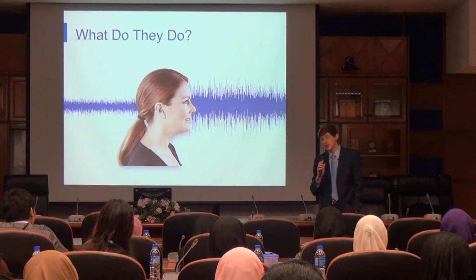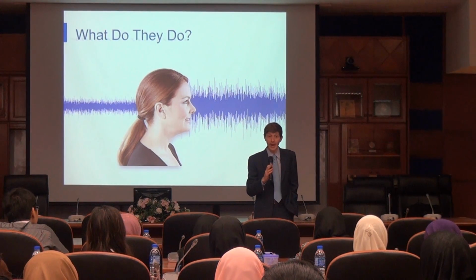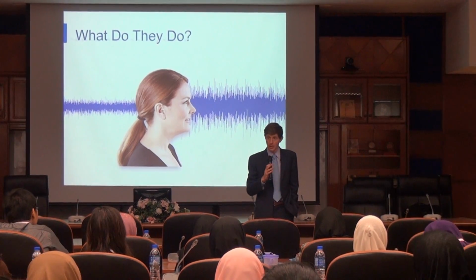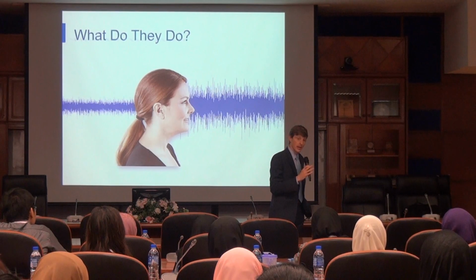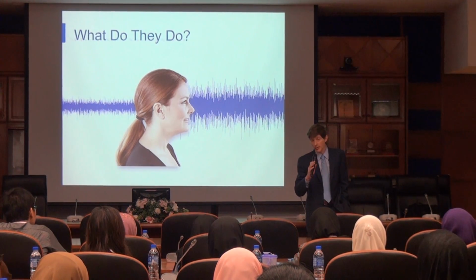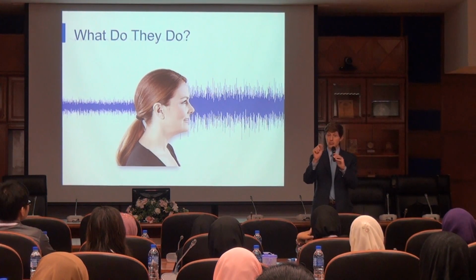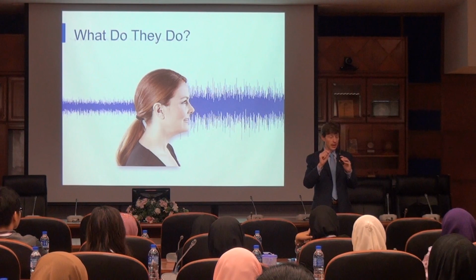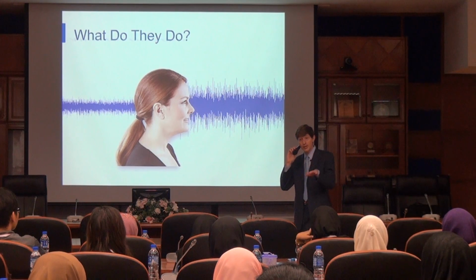Throughout the day I'm going to give you examples of how everyday technology around us, things we use every day or see every day, have hearing aid technology in them. And this microphone is a very good example. If I take this microphone, you can hear me well, right? And if I turn it around and I talk like this, you can barely hear me. My voice is very reduced.